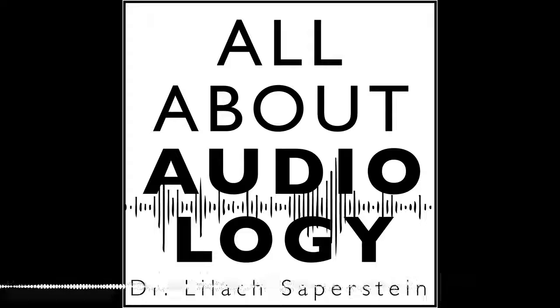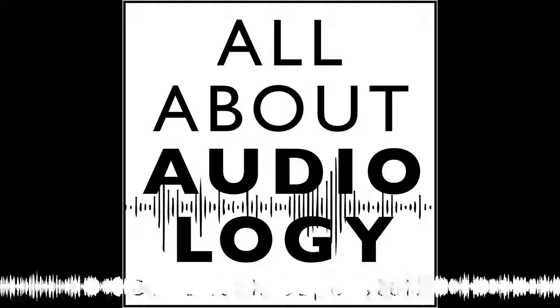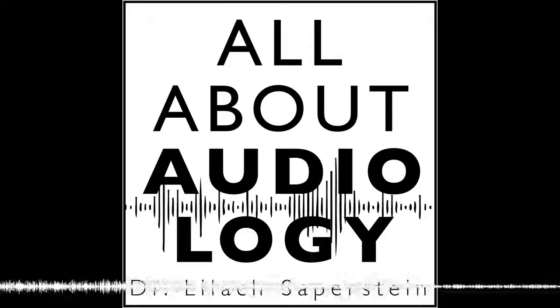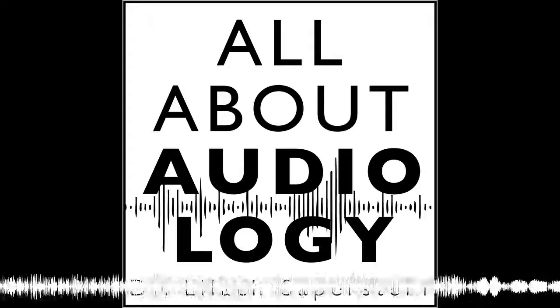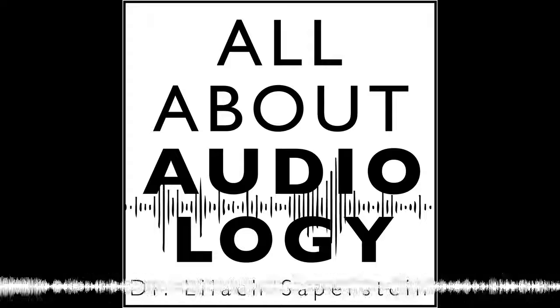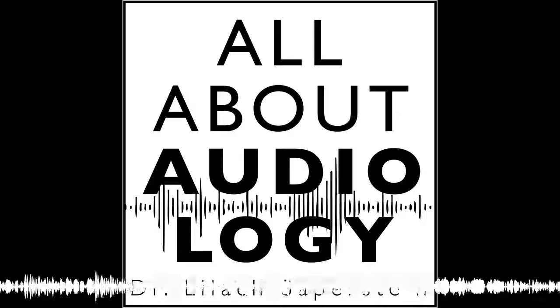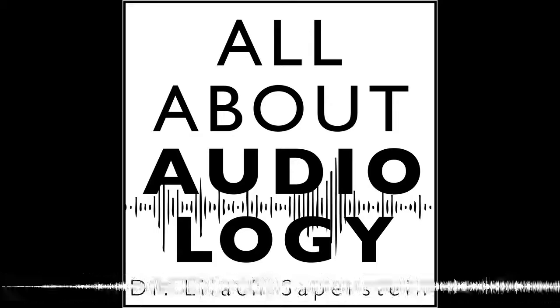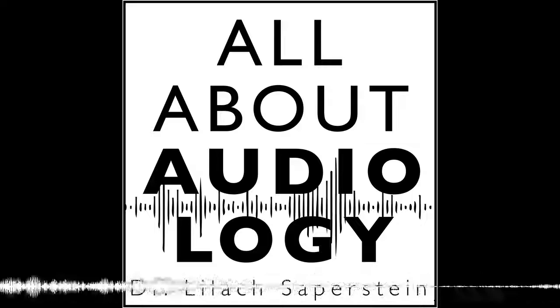And so I think that people are more familiar with the fact that electrical impulses are just part of our makeup. What we do with an ABR, we absolutely do a far field recording and a surface recording, because basically we can't get down to that hearing nerve. It would just be ideal if we could put an electrode right on that hearing nerve of that baby and we'd know exactly what they hear. But that's not going to ever be feasible. Maybe it will, 20 years from now. But right now we're forced with measuring far field away from that nerve by putting critically placed electrodes on the scalp.